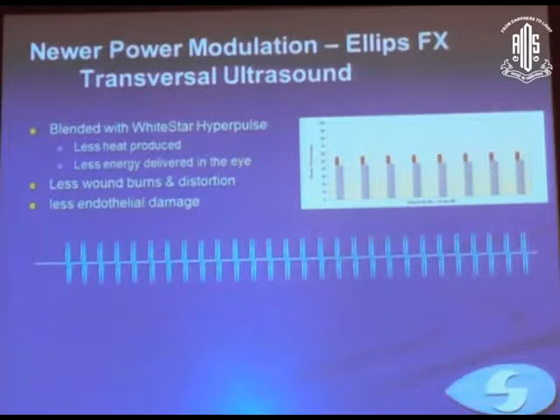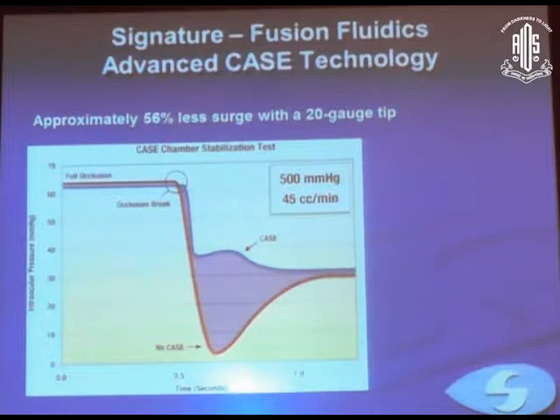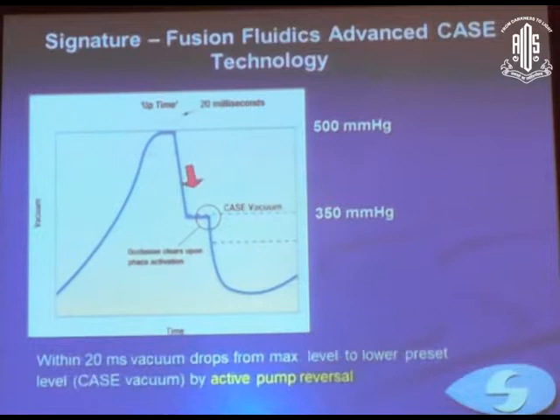The fusion fluidics we have talked about consists of two things: the CASE, which has been talked about by Dr. Kanslal quite extensively, and the fusion mode. So the Signature has both the fusion mode and the CASE. This I will not dwell upon again because this has been talked about by two speakers, how the CASE vacuum builds up and the vacuum breaks at a much safer level. And that is the whole idea, that the vacuum should finally break at a much lower level to prevent surge. So this has been covered.